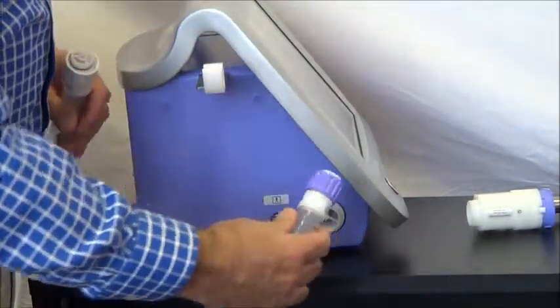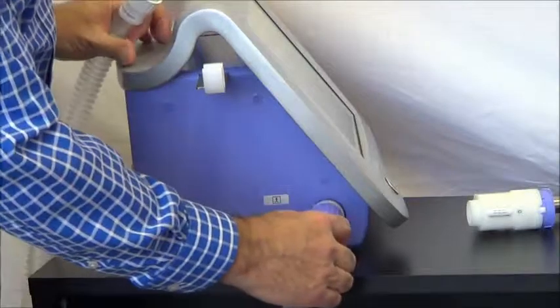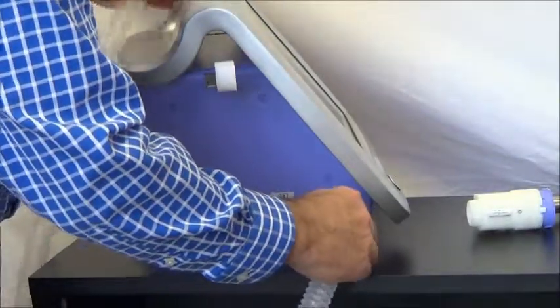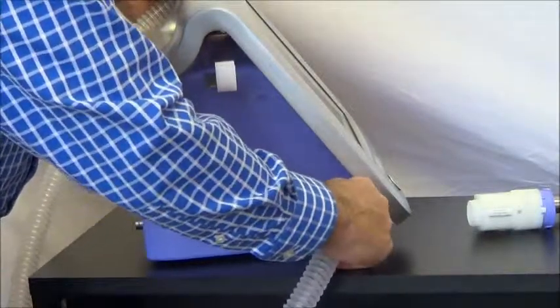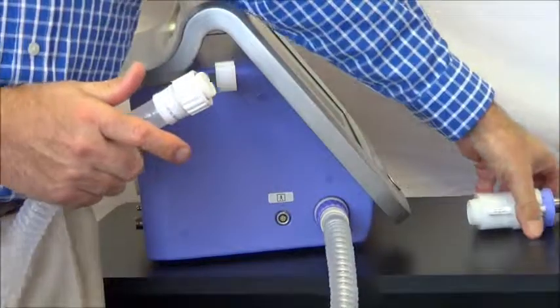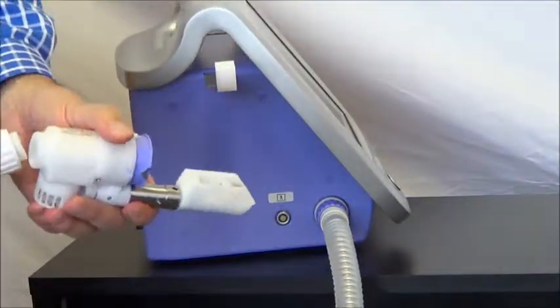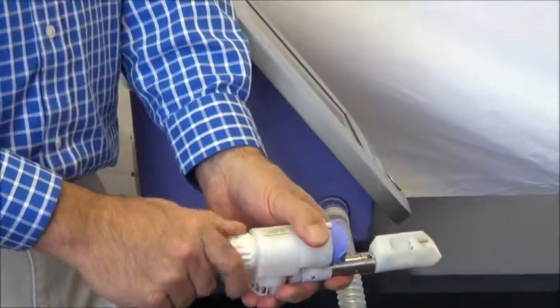With the new tube, there is a nipple that needs to line up in place, so make sure it is in nice and snug before you tighten the nut down. Notice again: the purple nut goes against the purple coloring of the device, and on the DLCO valve, the white nut matches up to the DLCO valve.